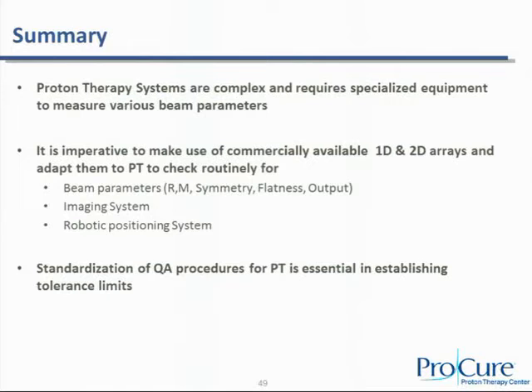It's adapted for proton therapy from vendors that didn't make it specifically for proton therapy, like KUKA, so you have to understand the system and all the corrections that go into it. The accuracy of the motion also depends on where you place the patient or QA device on the couch. You have to understand all of that, and it takes time to QA that and build a program around it to ensure consistency.